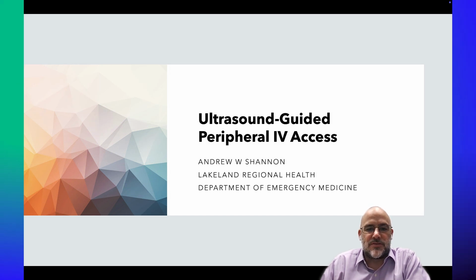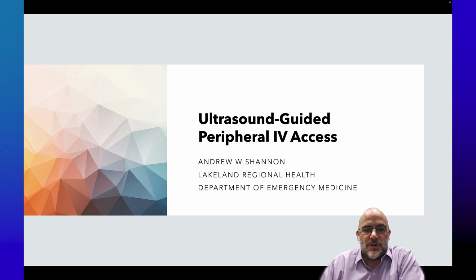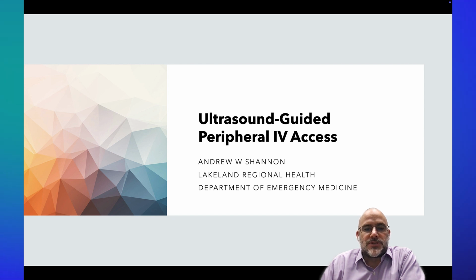I'm the ultrasound director at the Lakeland Regional Health Emergency Department, and we're going to be talking today about ultrasound guided peripheral IV access. Many of you will be looking at this video because you're going to be going through the credentialing process, and this should supplement any in-person instruction that you have.